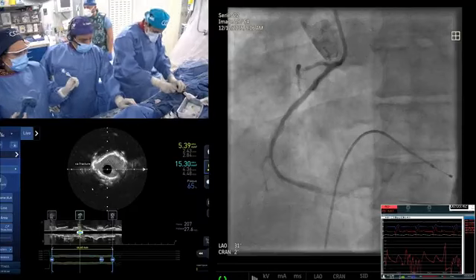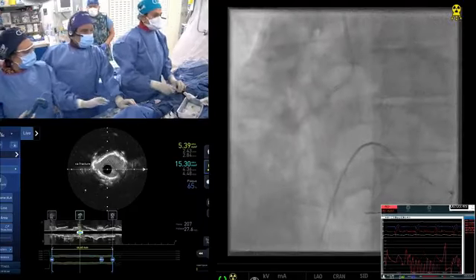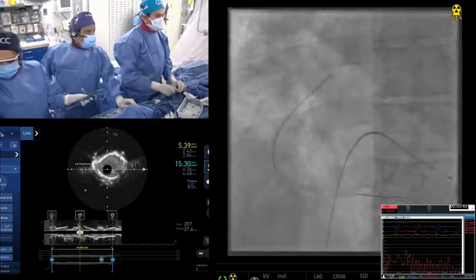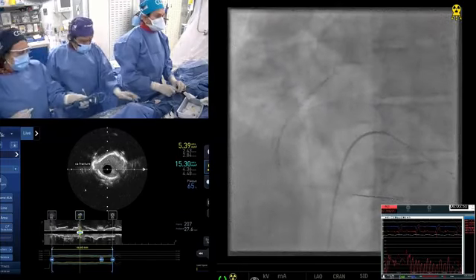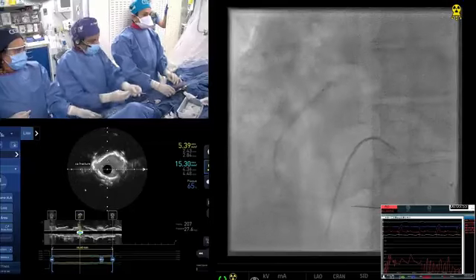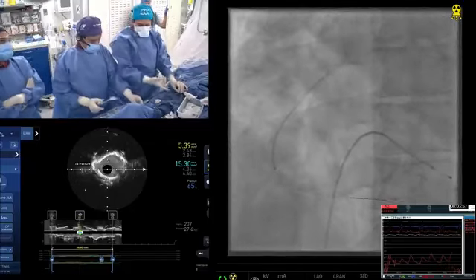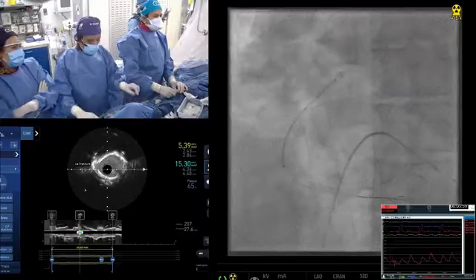Let's go. It's too long, remember? I told you, go further, then go to the other stent. No, no. We may lose... We already lost one RV branch. No, but you need to. We'll be losing too many branches.